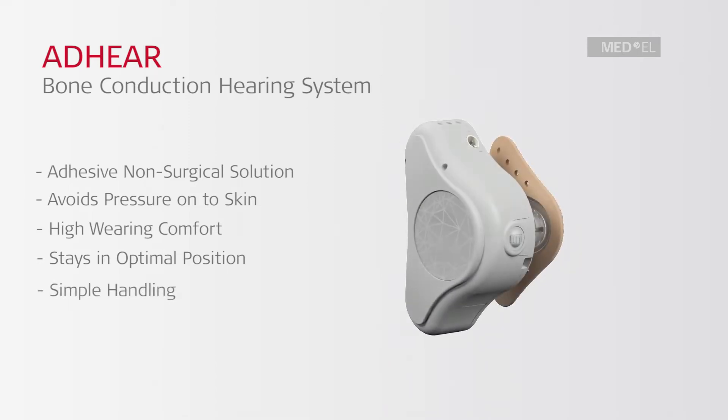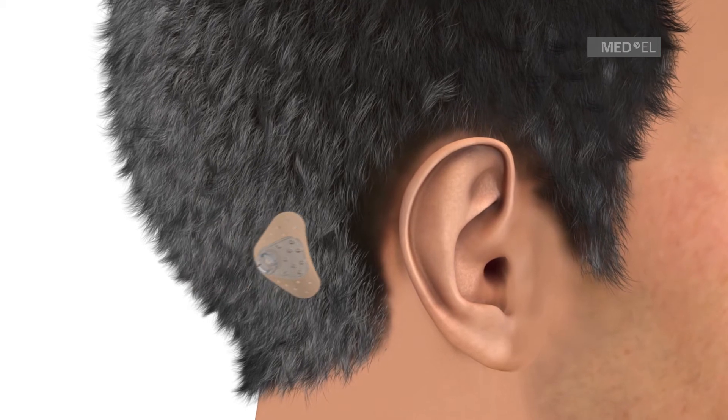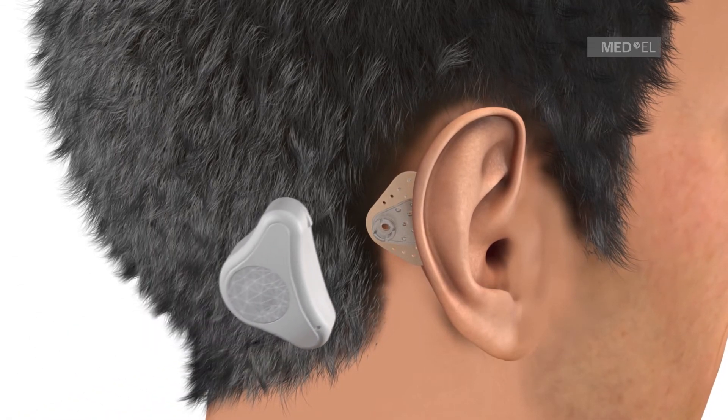Adhear is simple and easy to use. The Adhear Adhesive Adapter is applied to the hairless area behind the ear. The Adhear Audio Processor is connected to the Adhesive Adapter via the snap connector.